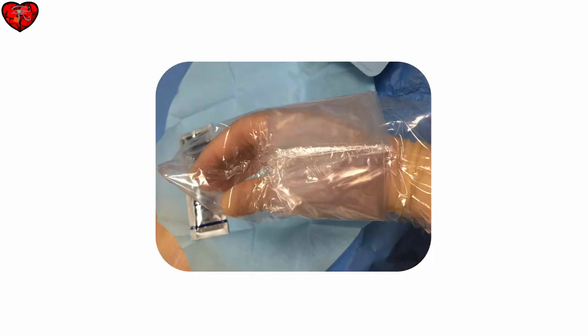Here is a completed probe cover with rubber bands in place. Usually it's best to place the rubber bands close to the probe face and then further down on the probe cord. You can also do this by yourself when you are sterile.